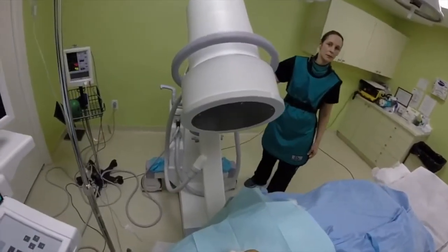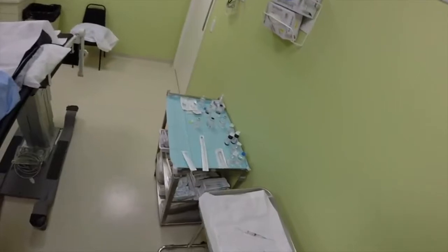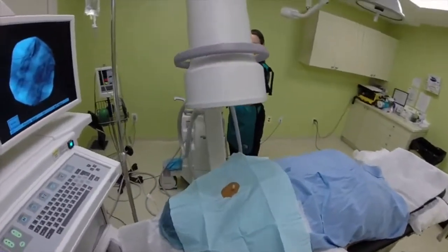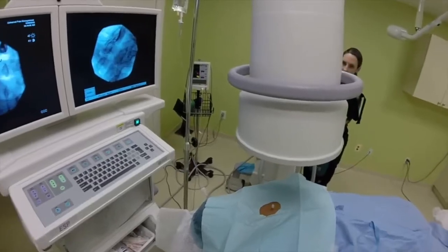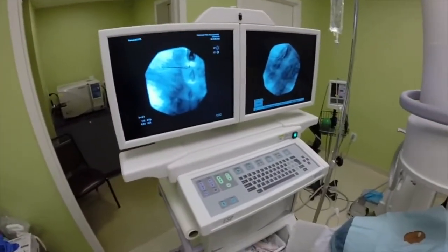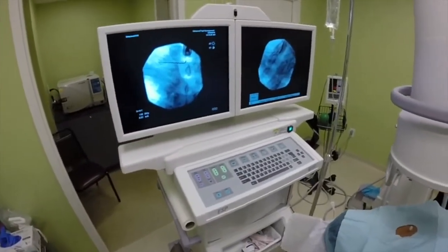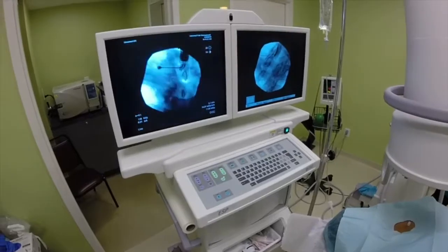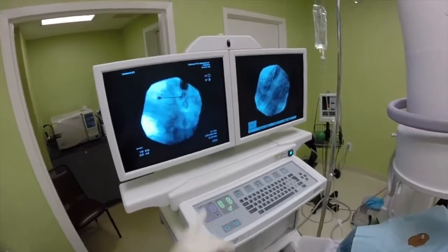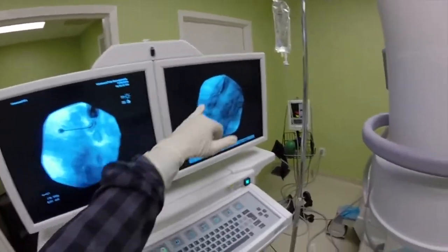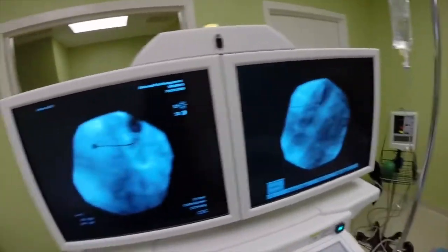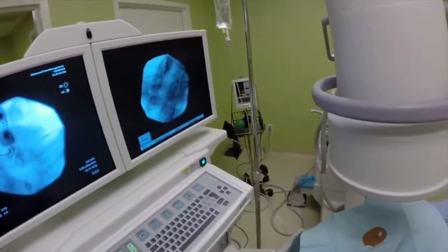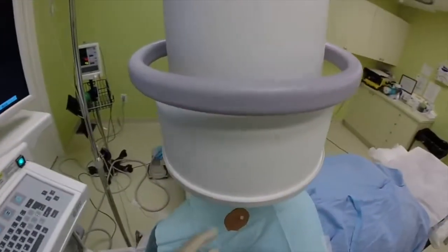Let's go for AP. That's my needle, and you saw clearly the medicine going to the epidural space, ventral to the ventral interlaminar line.